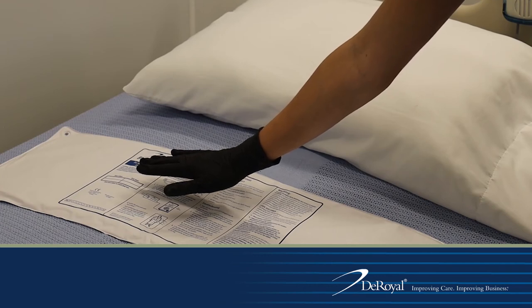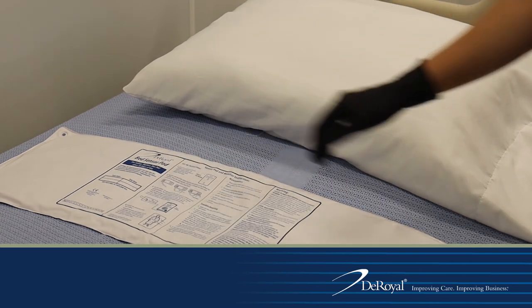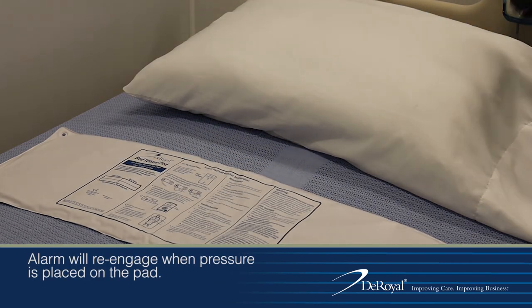Place the sensor pad on the bed and test the system. Place pressure on the pad to activate the sensor pad. The monitor will beep two times to indicate that the sensor pad and fall monitor are in use.